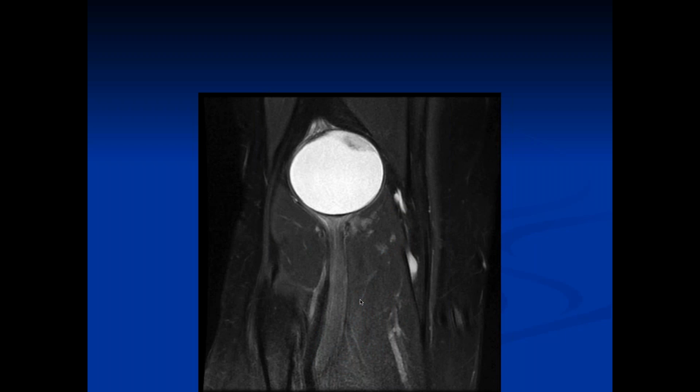So this is not an eyeball, but Max, what do you think this is? All right, let's see if I can do this blindfolded, with my eyes closed. There's a high signal intensity on fluid sensitive sequence. Yeah, I can see your mouth. Where are we anyway? This is the optic nerve. Light bulb. Can we use a light bulb? Is that the eye? No, this is the back of the knee, by the way. Back of the knee, okay, that helps a lot more.